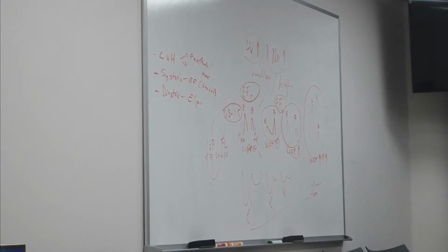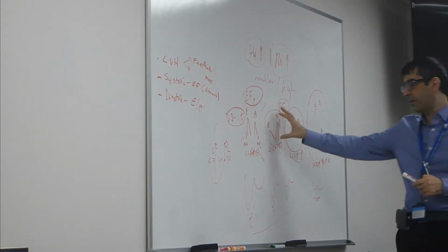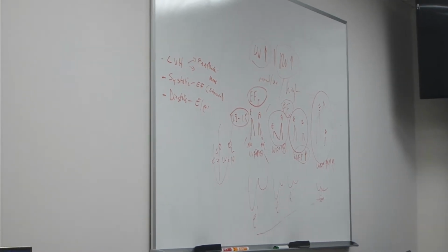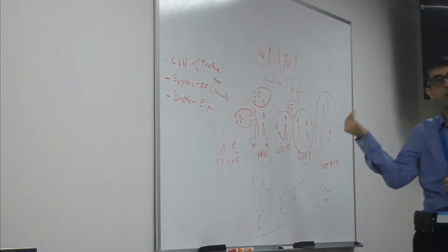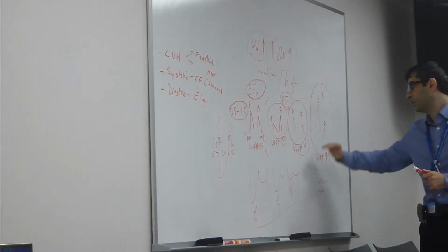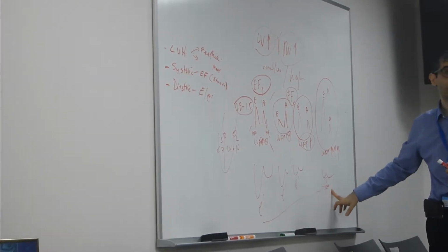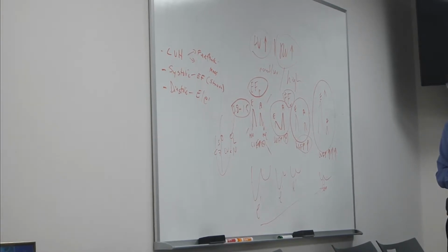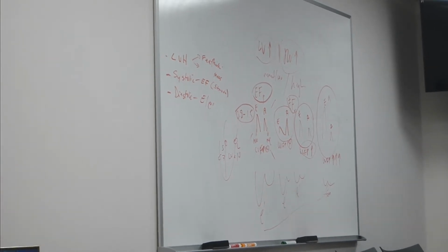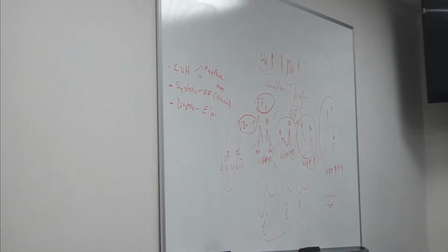If you're in the emergency room and somebody has shortness of breath, and you see the relaxation filling pattern with decreased tissue velocities, you know they have diastolic dysfunction. At the same time, you know their filling pressures are probably normal. They're not overfilling the ventricle. But once you get to pseudo-normal with low tissue velocities, or restrictive, especially restrictive filling with very low tissue velocities, then you know there's a problem. The filling pressure is probably high. The problem is that this works beautifully in theory. In practice, it doesn't always work. That's why you need other supportive signs indicating that the filling pressures are elevated.